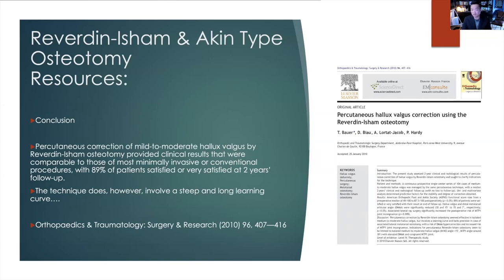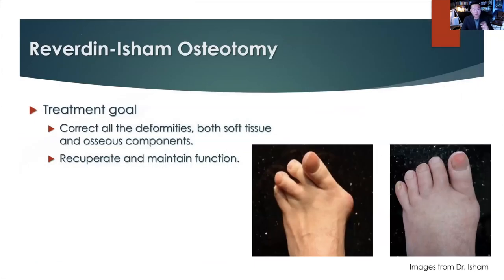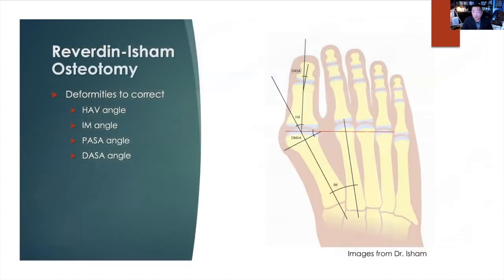It is evidence-based. Okay, so the Reverdin-Isham osteotomy treatment goal: correct all the deformities of hallux valgus, both soft tissue and osseous components, and recuperate and maintain function of the first MTPJ. The beautiful thing about Reverdin-Isham osteotomy is that it corrects multiple parameters, like a three-dimensional correction. It corrects HAV angle, IM angle, PASA angle, and DASA angle.